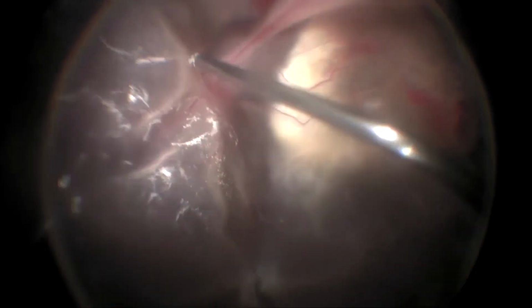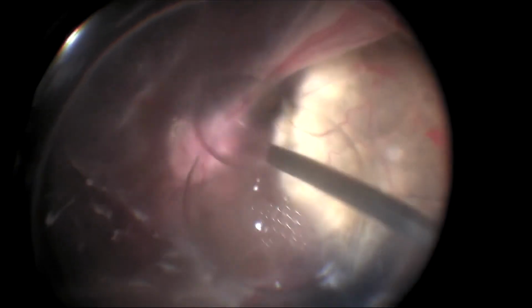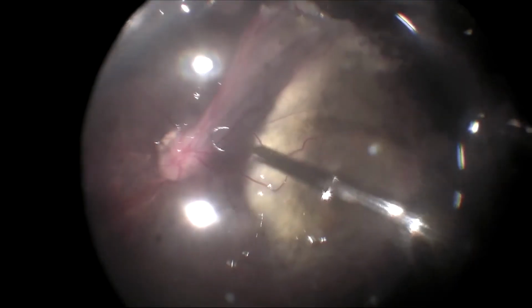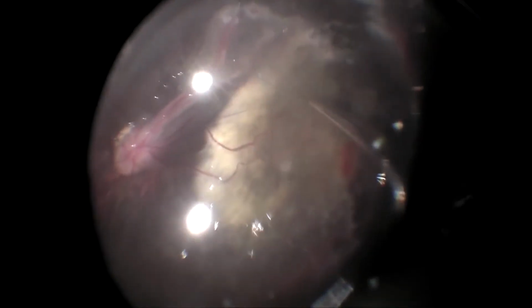Removed triamcinolone stained vitreous schisis membranes. Injected heavy fluid PFCL and removed all vitreous. Peripheral circumferential retinectomy was done for redundant retinal fold and air fluid exchange started. Injected more PFCL beyond the retinectomy margin to flatten the retina. Then I used a Flex loop to unfold the residual retinal fold as much as possible.